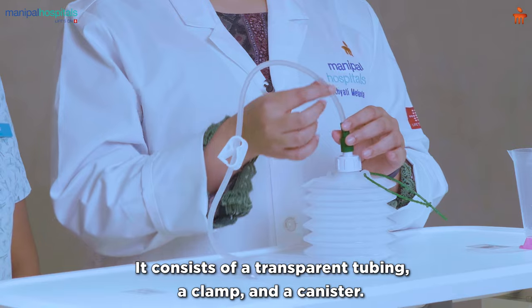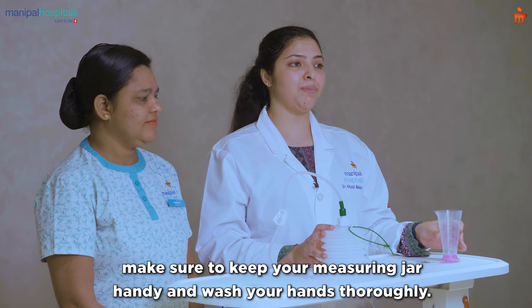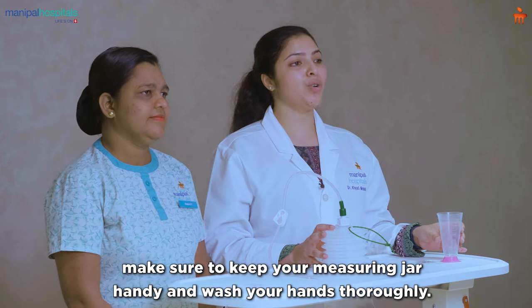This is your drain. It consists of a transparent tubing, a clamp, and a canister. Before you empty your drain, make sure to keep your measuring jar handy and wash your hands thoroughly.